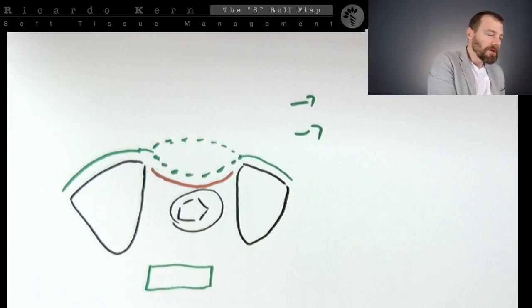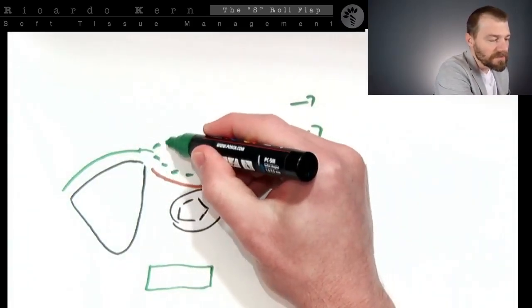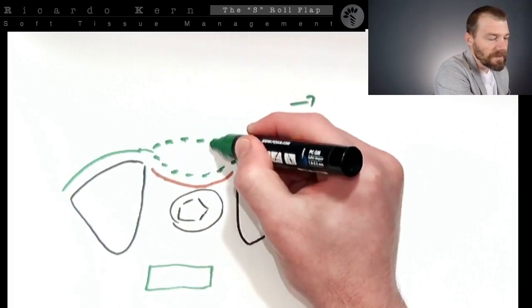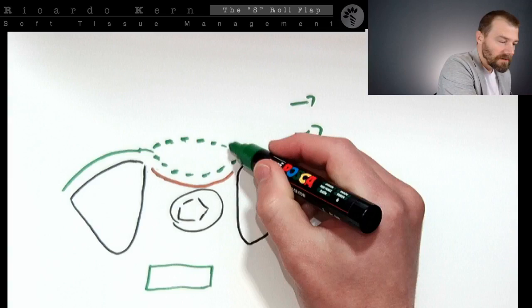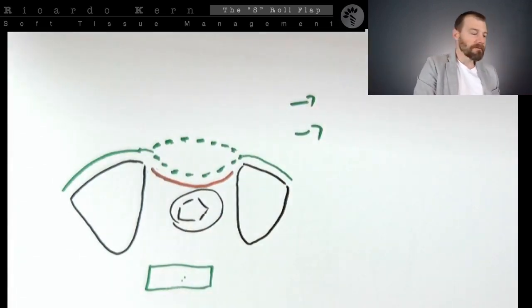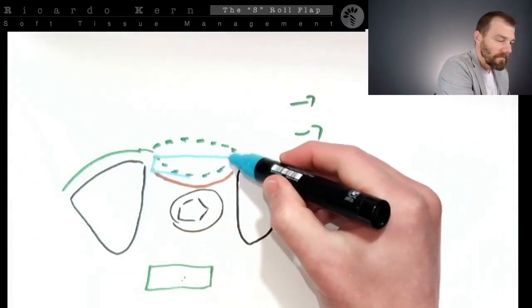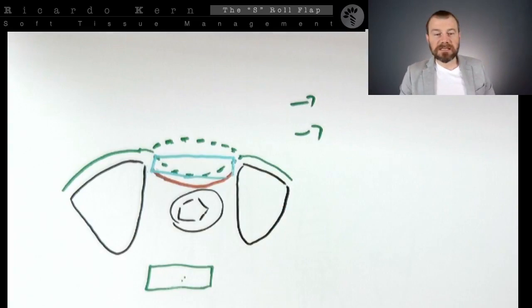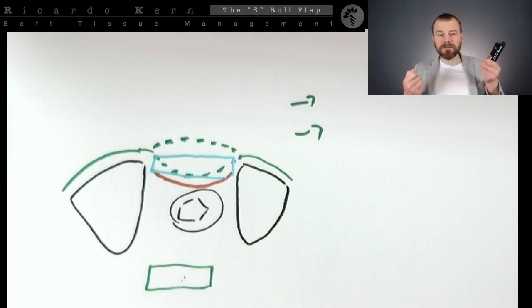It's going to be the total length of tissue that you need to move to the outside of the arch and to open this place for this connective tissue graft to be tucked inside this area. The question is, are you going to need extra tissue to be released to cover this connective tissue?